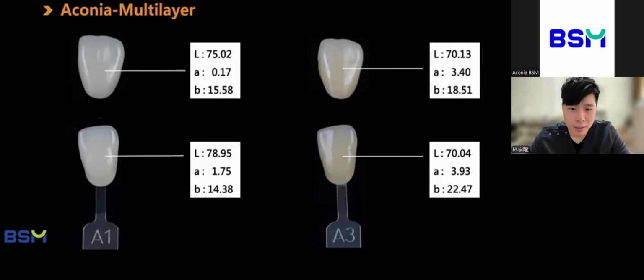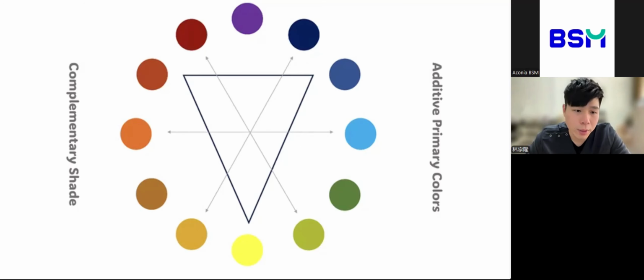So basically, all stain liquids are designed from the three primary colors, red, blue, and yellow. So you will always use these three colors when making the restoration. In fact, most colors can be made just from these three, but there's another very important concept you need to know.